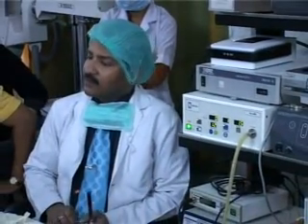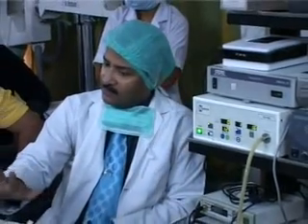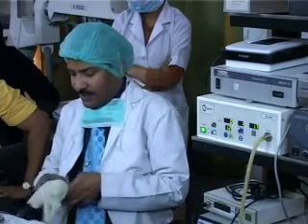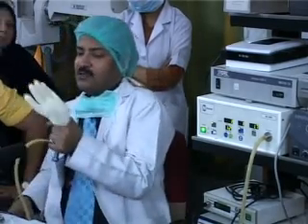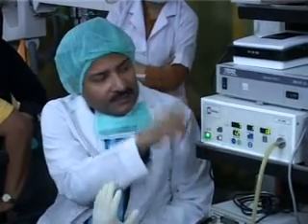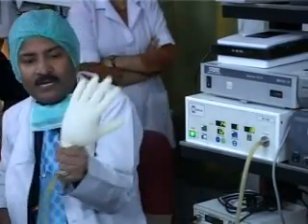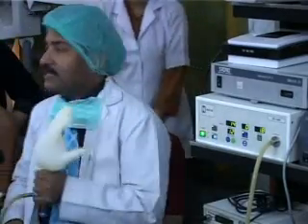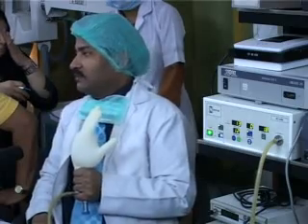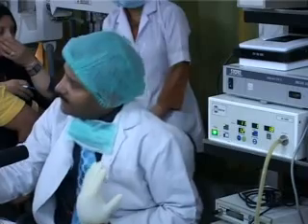How much do you want? Pardon? One? This is 1 liter per minute. Continuously one. And if you attach it with the abdominal cavity, then the flow will also be 1. And this is slowly 1, 4, 5, 7, no error, no fluctuation, 10, 12. And as soon as this 12 comes, the flow is stopped. The flow rate is 0. Actual pressure is 12 and it is stopped automatically.